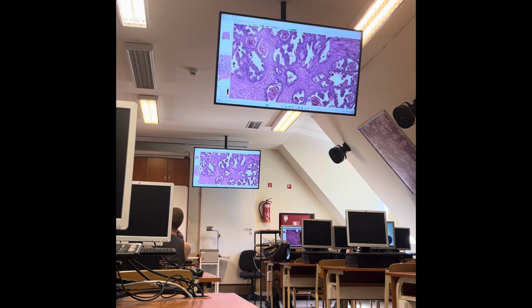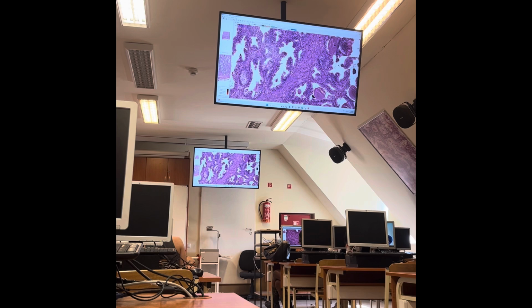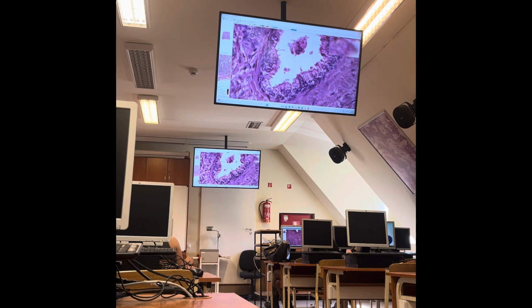And then embedded into this stroma, we can see the tubular glands. Some of them contain certain structures, but let's find first the gland where we do not see any content in the lumen. So these are also secretory cells, glandular epithelial cells lining the lumen. And you can see a similar phenomenon or similar morphology here as in the seminal vesicle, that the shape, the size of the epithelial cells is changing.